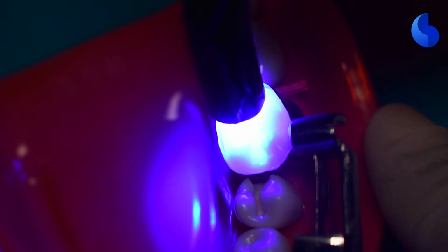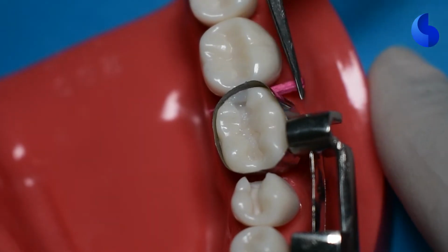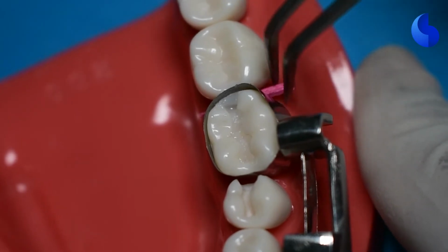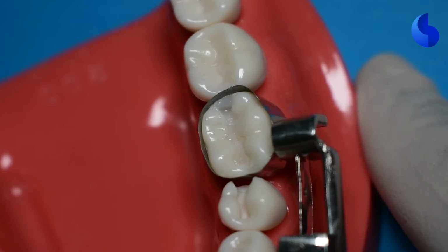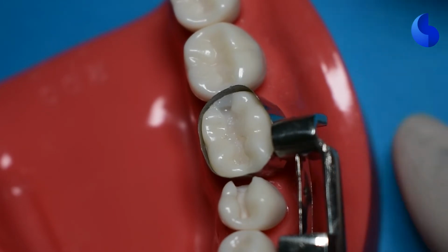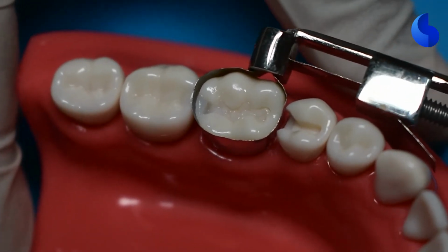Once you're happy with how much material you've condensed in the proximal box area and you've created a wall, you can now go ahead and remove your wedge and your matrix band. Because right now, you only need to add material in the occlusal aspect of the cavity, which can be easily done since you've already completed the box area.